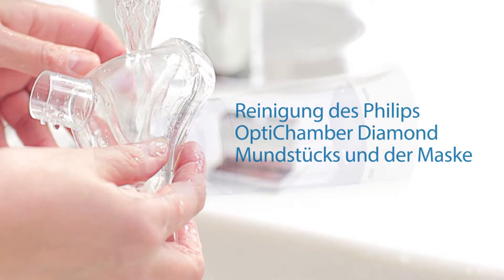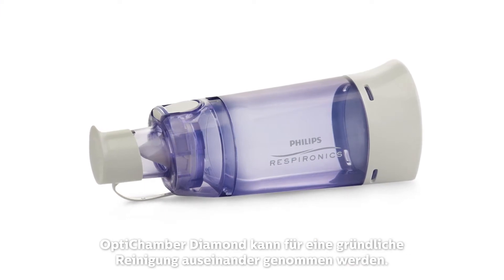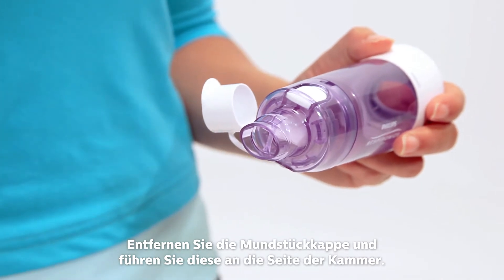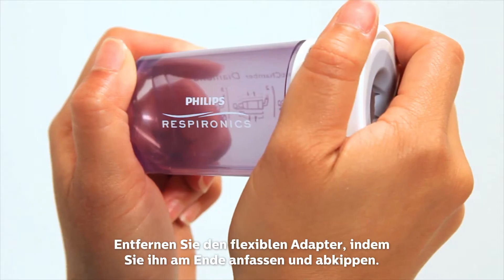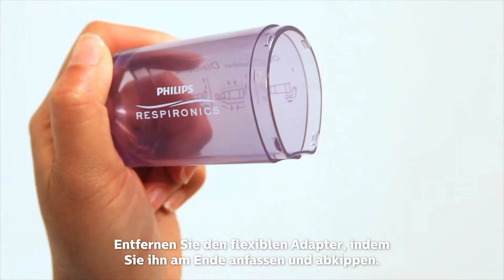Cleaning. Diamond can be taken apart for thorough cleaning. Remove the mouthpiece cap and move it to the side of the chamber. Then rotate the mouthpiece to the right and pull apart to disassemble. Remove the flexible adapter by gripping the end and tilting the top back.